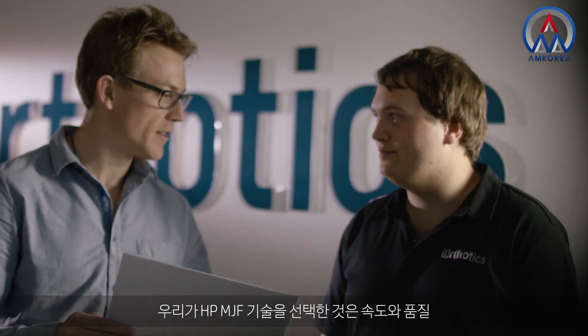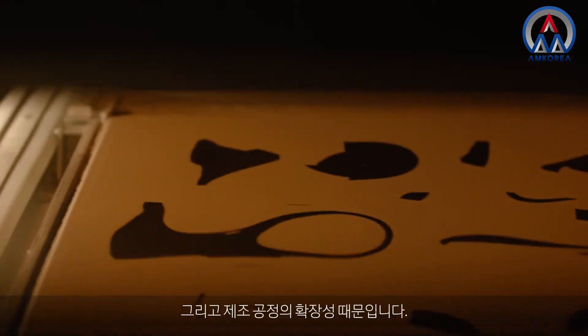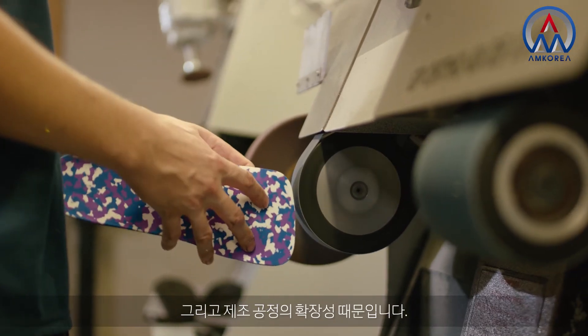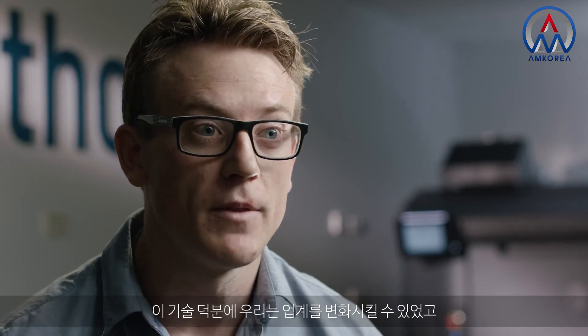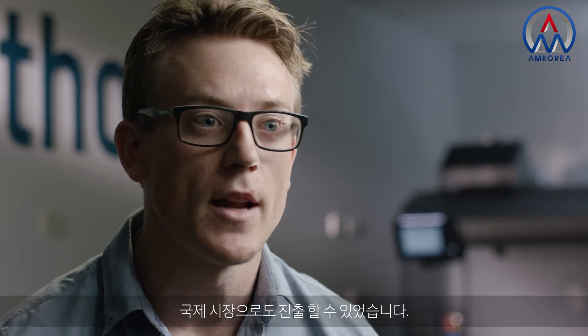At school I play tennis and volleyball — it's so much easier with the orthotics in. We chose the HP MJF technology for speed, for quality, and for scalability of our manufacturing process. It's helping us to change our industry, which we're really excited about, and it's helping us to move into international markets as well.